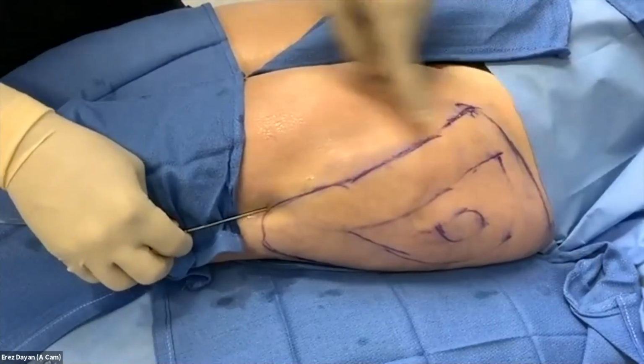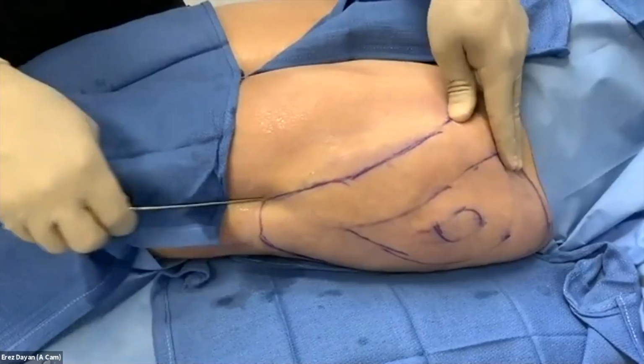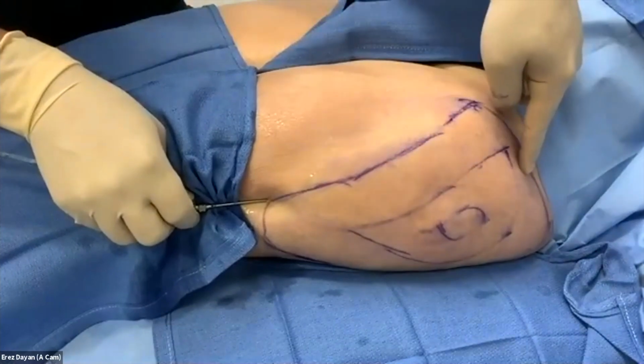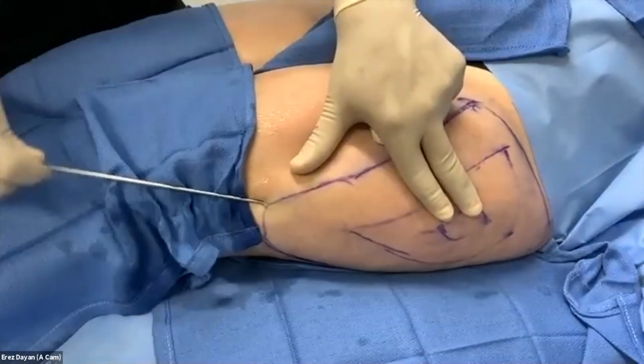I'm going slow here, and you really want to see it filling ahead of you, making sure the whole area is tumesced well. I'm deep, in that plane right above the fascia. You see how it's filling up nicely. So that's it. Now I'll come more superficially and test myself.